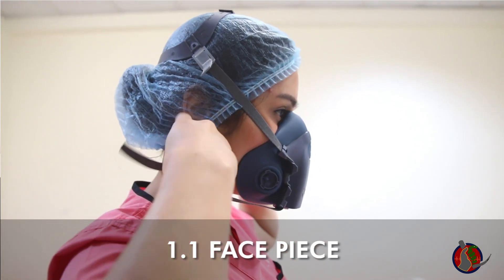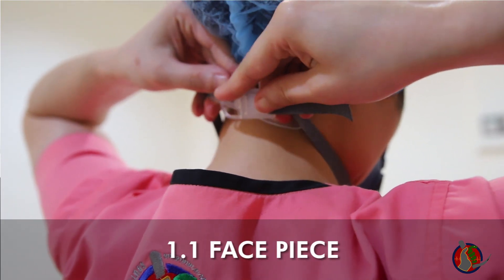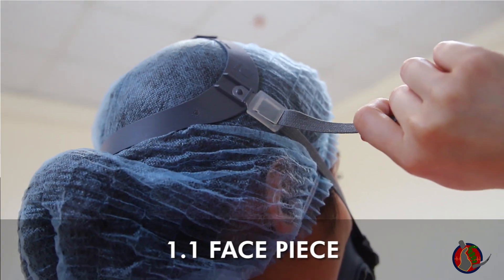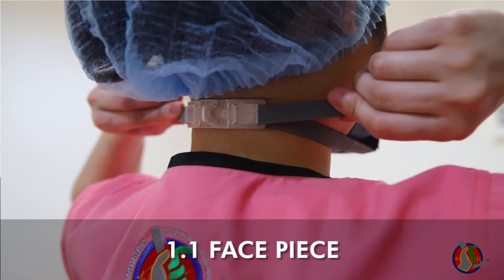With the mask now on your face, grab the neck straps with your two hands and lock in place. Adjust the tightness of the strap by pulling the head straps first, then the neck straps, until you achieve the most comfortable fit.